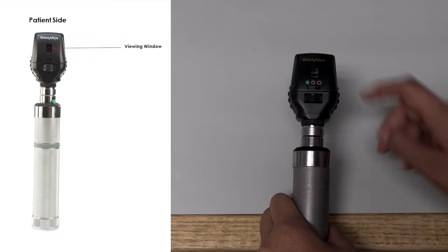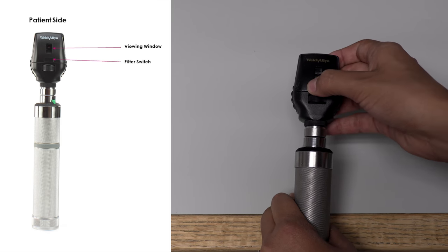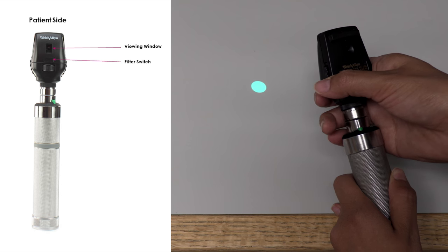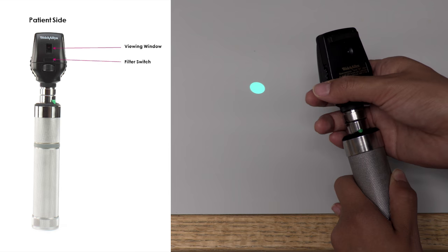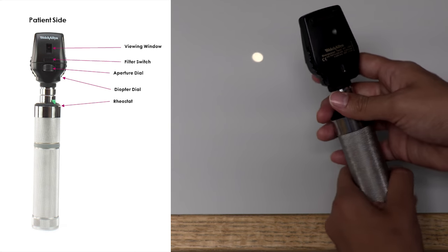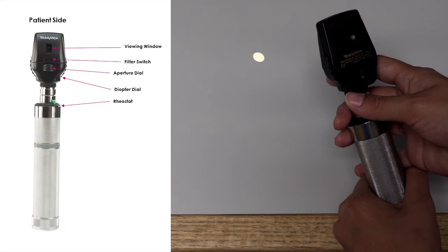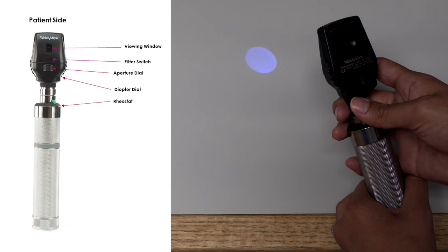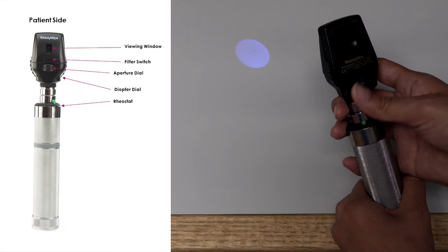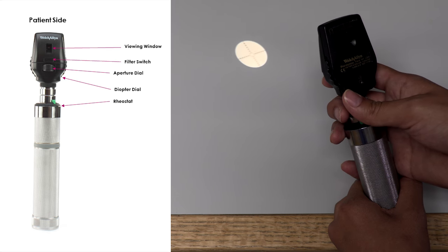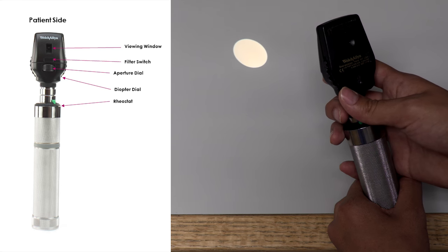The patient side includes the viewing window and the filter switch. This switch allows you to change the color of the light. The red-free light allows you to look more closely at the vasculature. The aperture switch allows you to change the size of the light. The small aperture allows you to look at a constricted pupil in a well-lit room. The blue light allows you to look at corneal abrasions or ulcers with the use of fluorescing dye. The slit allows you to look at contour abnormalities. The grid allows you to measure distances between lesions. The large light allows you to look at a dilated pupil after using mydriatic drops.